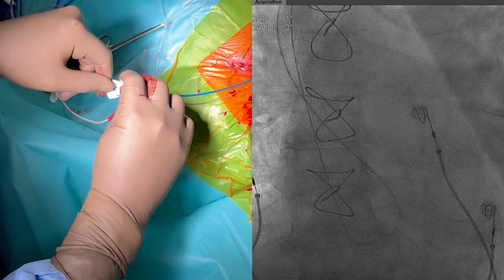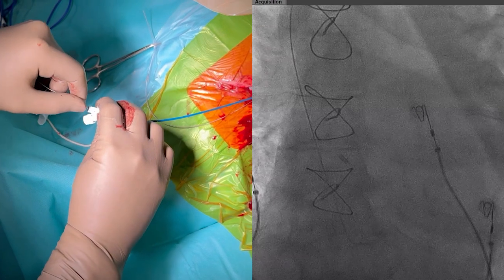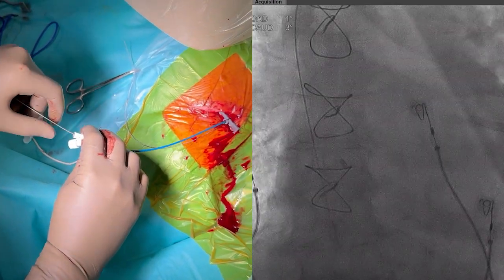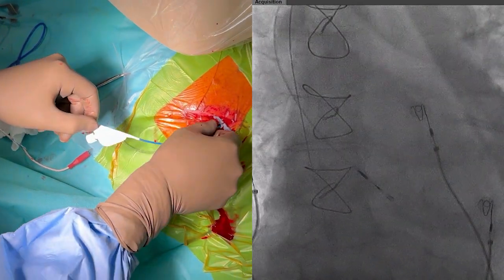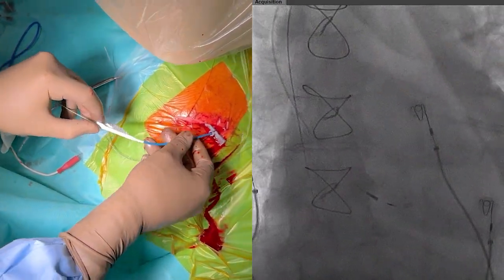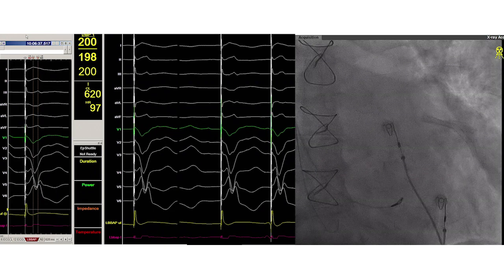The dilator and guide wire can now be removed to allow insertion of the pacing lead. Note that this lead has an extended and fixed helix and is very thin when compared to conventional pacing leads. The lead can now be introduced while making sure that the distal end does not exit the guiding catheter.